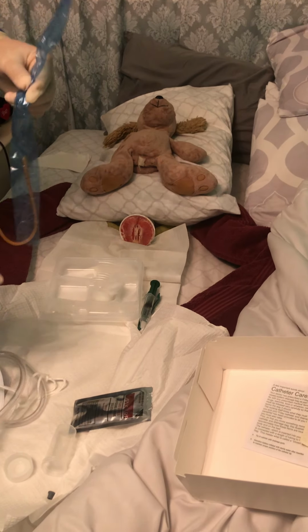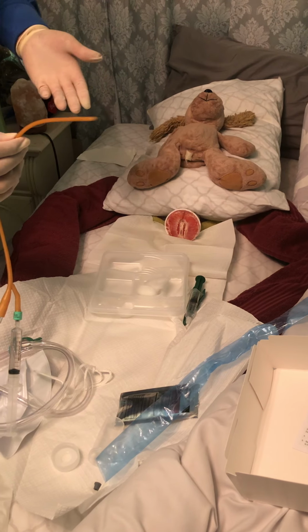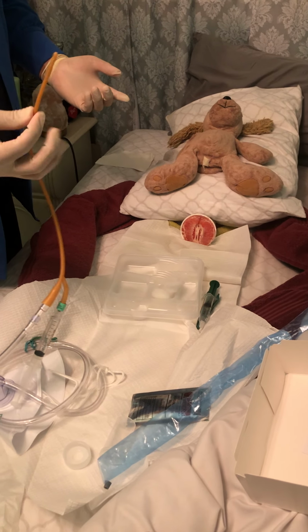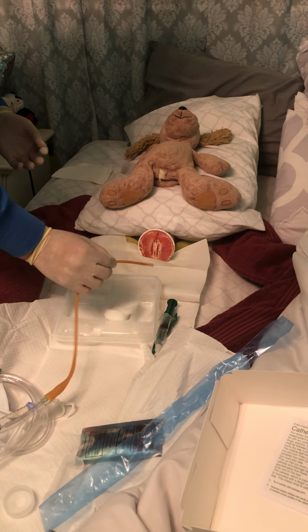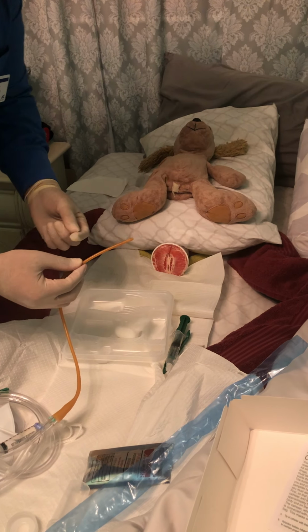And then you would take the catheter out of this wrapper. As it's moving around everywhere like that, you don't want that. So you kind of want like a firm grip on it, maybe 4 or 5 inches. And what you would do, you would twirl around in the lube. And so let's say it's all lubed up.